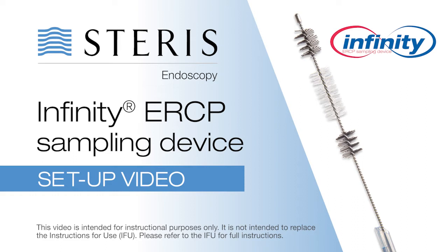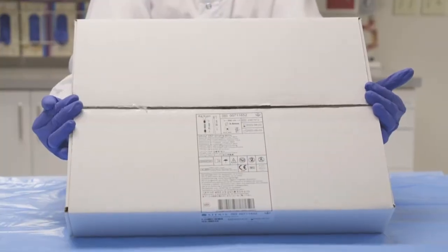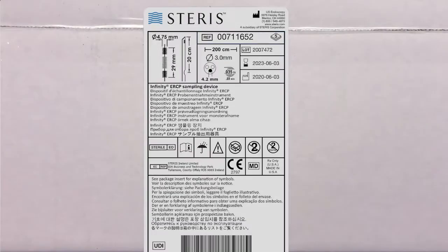Steris Endoscopy's single-use Infinity ERCP sampling device comes packaged sterile, 5 per box. The labeling includes the following information: the order number, the product dimensions and specifications, lot number, date of manufacture, and use by date.